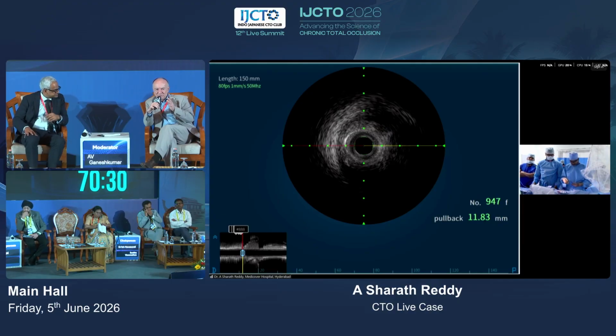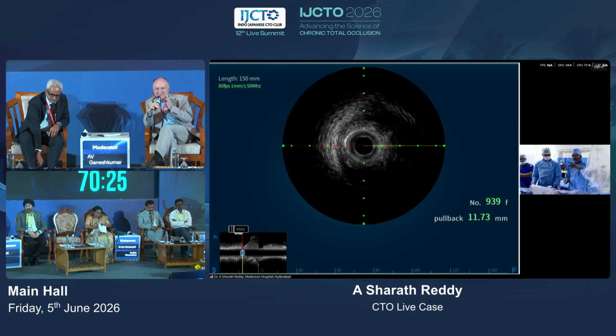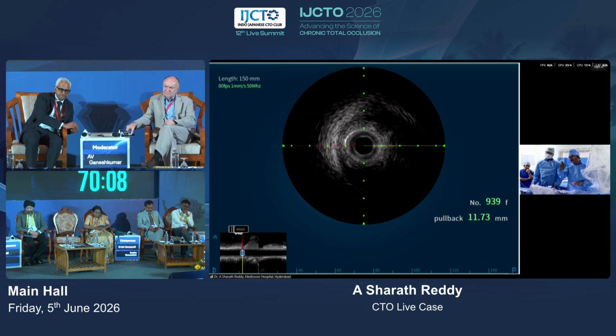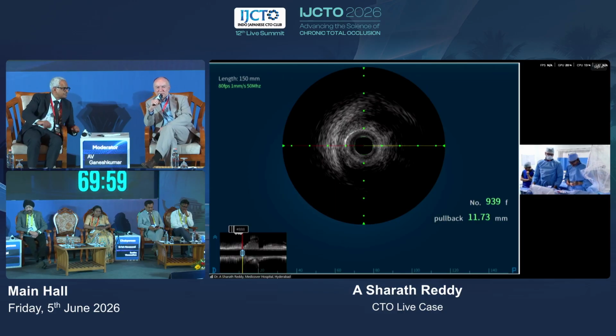But you had a view where you told us that you could have used a dual lumen catheter in that position to puncture right in this direction. Yeah, to use a dual lumen catheter from this branch, the wire is not going distally. The wire is just stuck at the bend in the vessel there. Yeah, I think that's a nice choice, but honestly, I didn't consider that option. Okay, so you go to the retrograde.